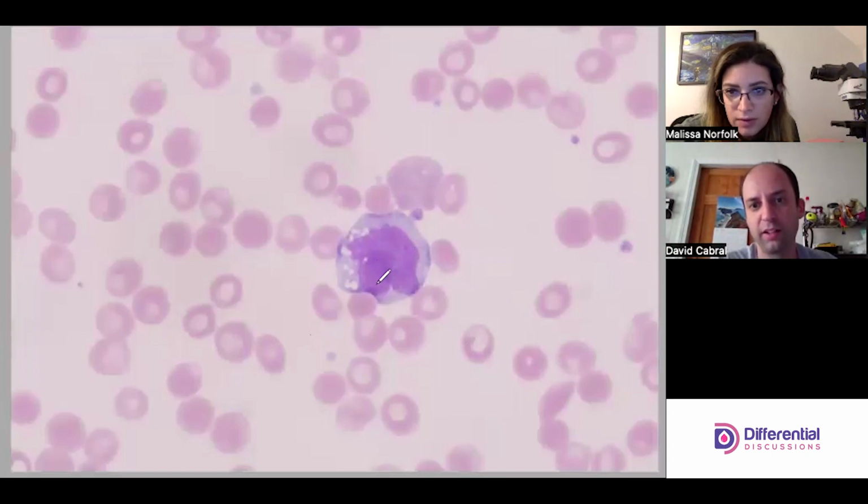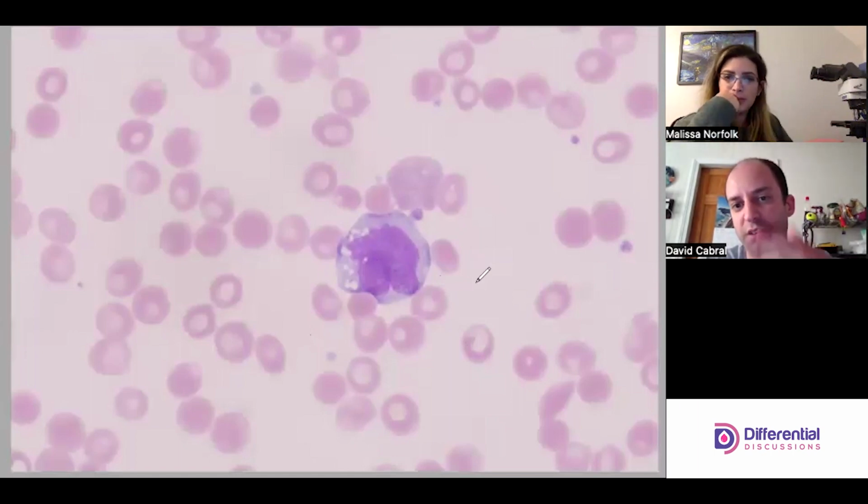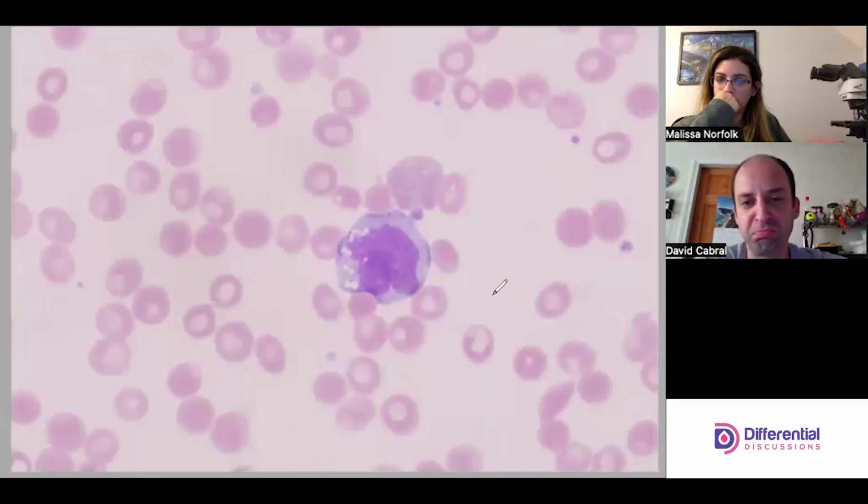Maybe I'm overseeing it on my side through Zoom, but I don't really see a super prominent one. The one you pointed to, I can't even really see anything on my side. Could be just the way the video is. It doesn't have a nucleoli, but I think it's soft enough to be a pro mono anyway. The texture of this one right away was like, that's young.